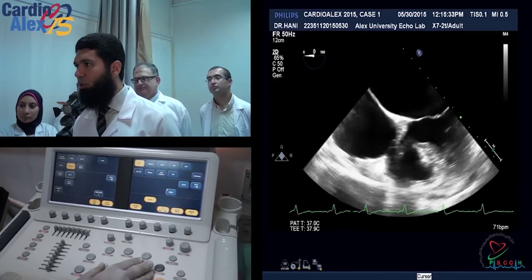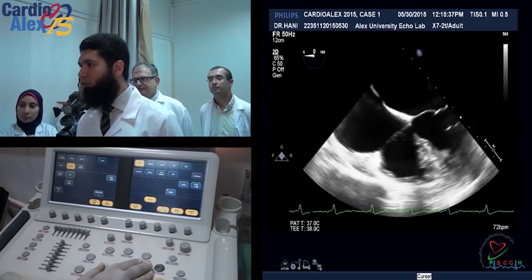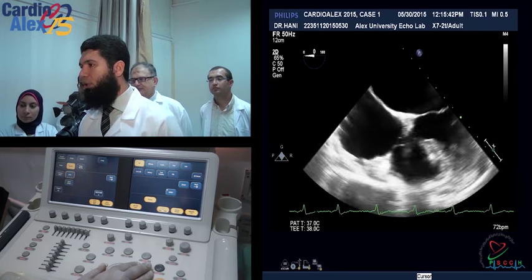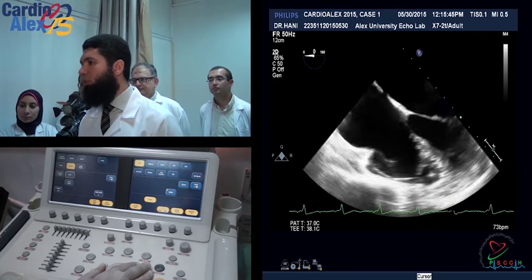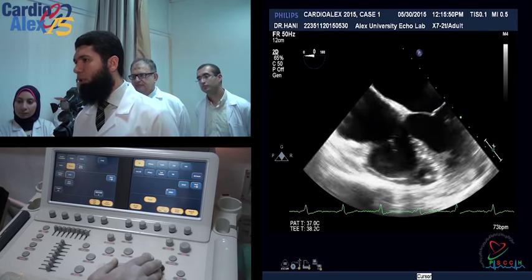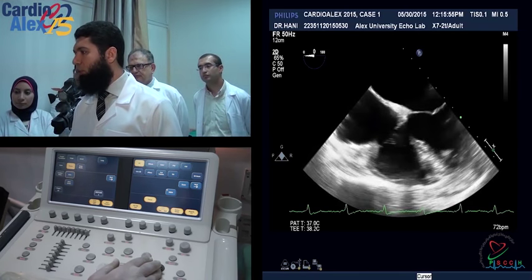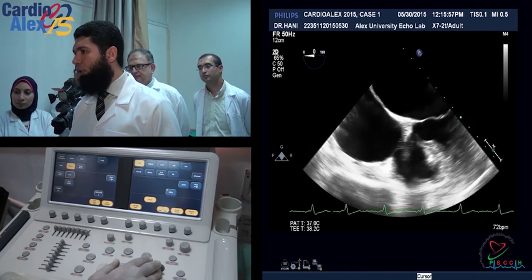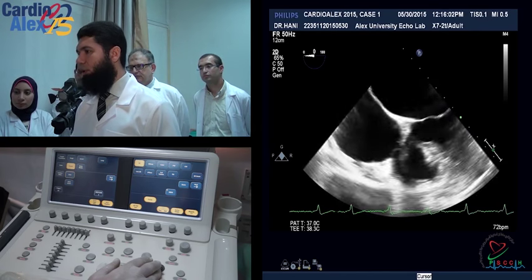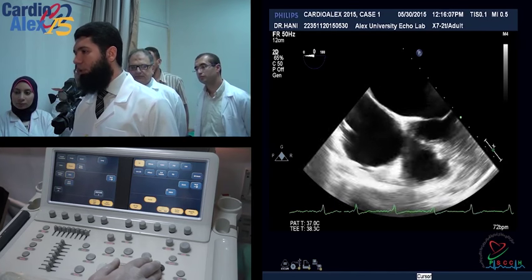This is the first case of Life in a Box in Cardioalex. Hopefully it will be beneficial for all. Today this is a case of mitral valve prolapse for the assessment of the feasibility of mitral valve repair. Apart from the diagnosis, we'll explain how to do the 3D TEE exam step-by-step, including all the acquisition modes at the beginning.